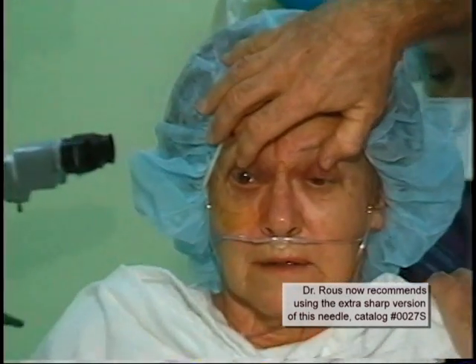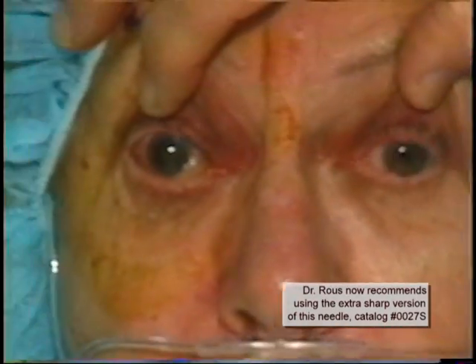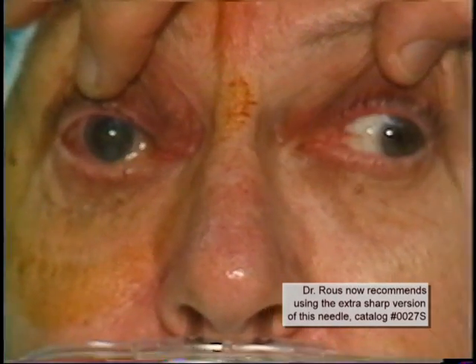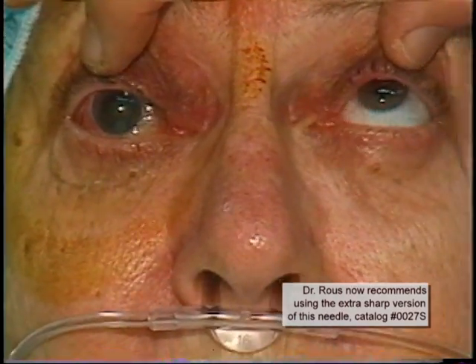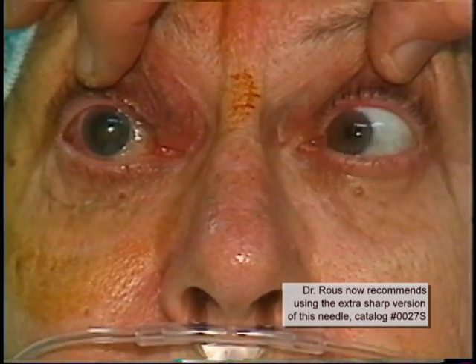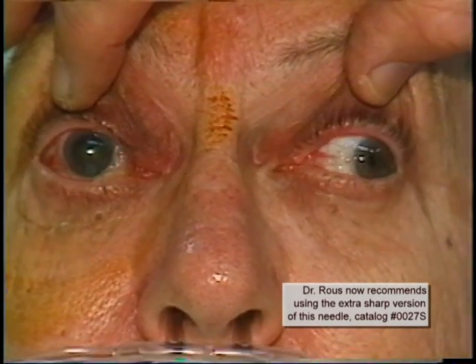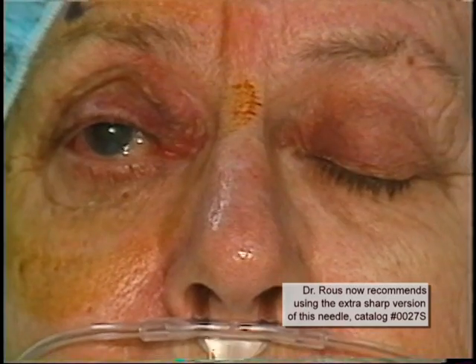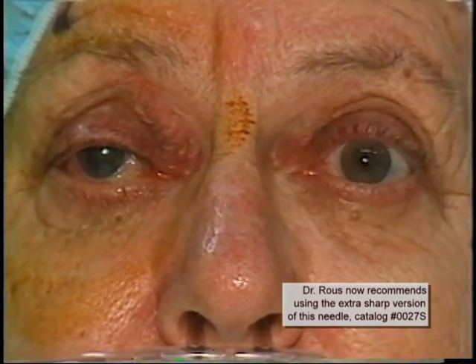Notice that we have achieved excellent akinesia. There is essentially no movement of the right eye up, down, right, or left. Also notice that we have achieved a lid block as well, just from the sub-Tenon's injection.